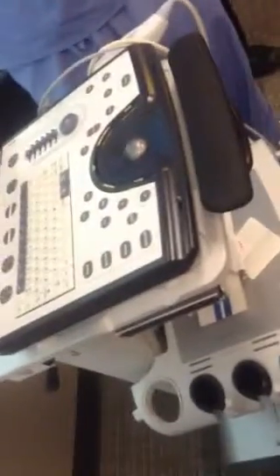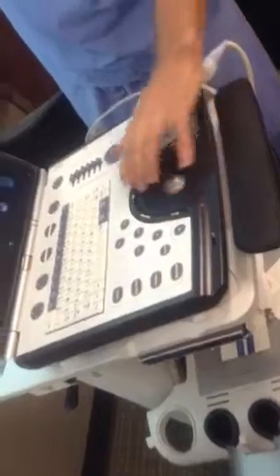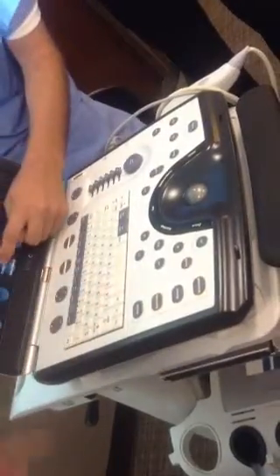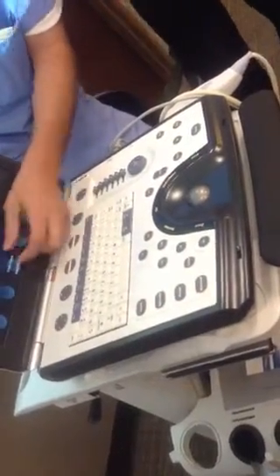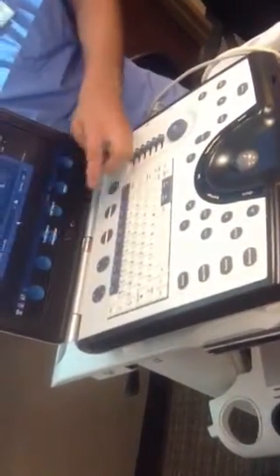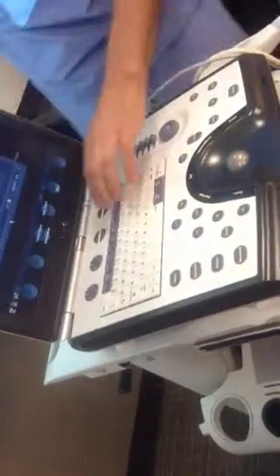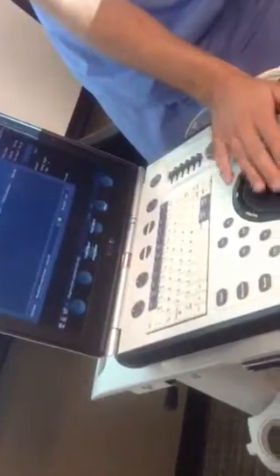Okay, so now I've got the patient. I'm just putting in test and some random numbers. And we're going to select patient. So if somebody wants to hit the select patient button there. And you'll see, it doesn't like that. You'll see this shape right here corresponds with these. So it says create patient, select patient, clear search, more. Those are going to be corresponding there. It wants to create a new patient, so we'll create.